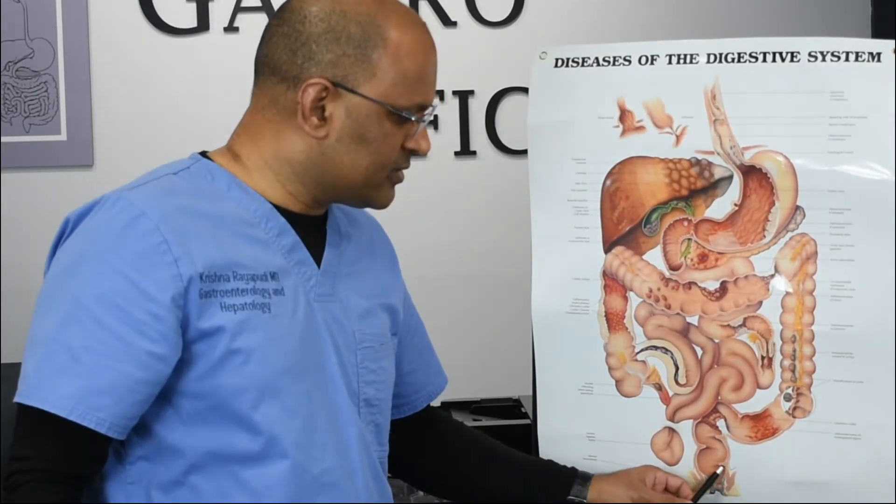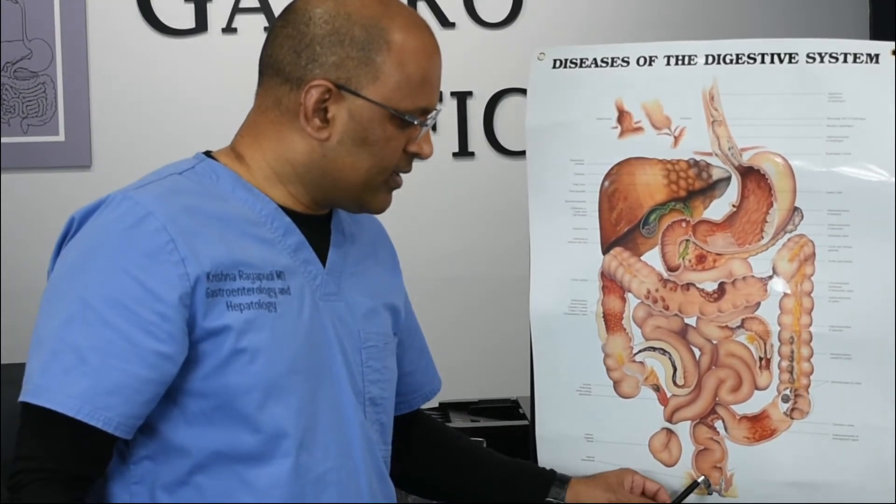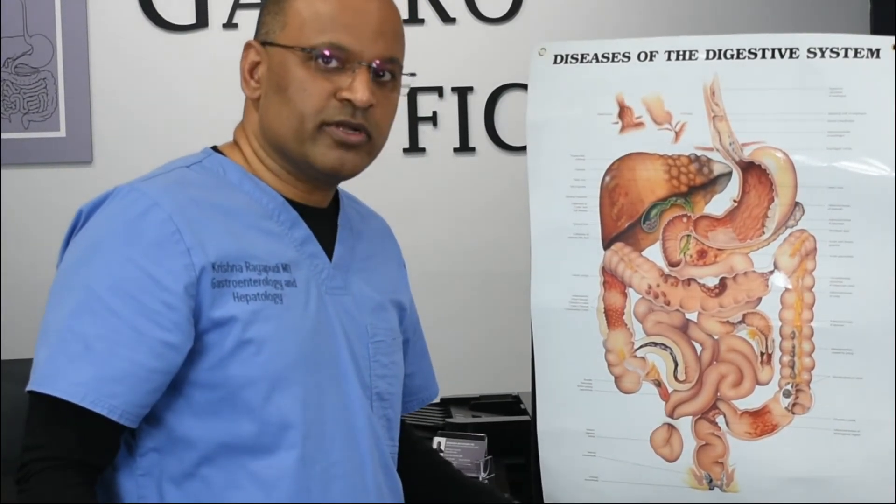And these are hemorrhoids. You see them at the bottom. There are internal hemorrhoids and external hemorrhoids.